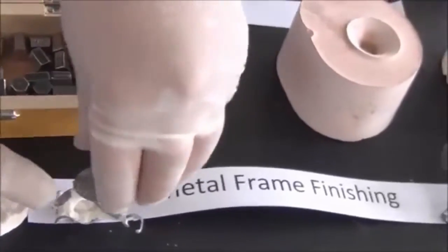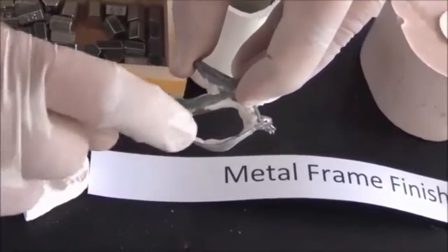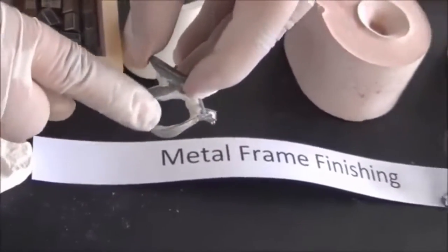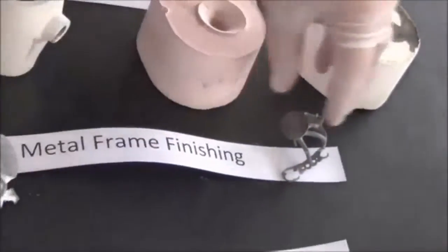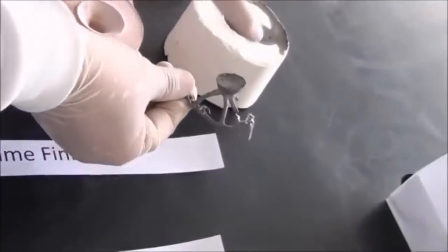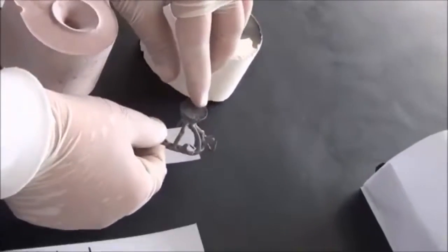This metal is further cleaned by hammering, and then you will get fine particles of investment. These are also cleaned by a process called sandblasting. And finally, I get the metal framework that was embedded inside this investment material, now free from all investment material.